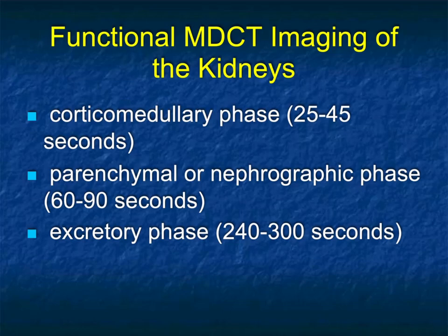CT. So now we can look at the kidneys. Now, it's important to recognize, I always like to think about it, whether we're looking at tumors or infection, whether we're looking at inflammatory disease, whether we're looking at neoplastic disease, the way we give contrast and the timing of the contrast will really determine both our ability to detect lesions as well as our ability to be very discriminatory as to what the lesions are.